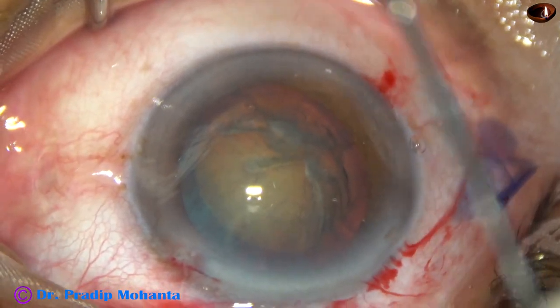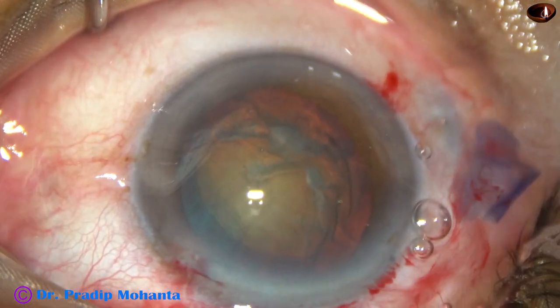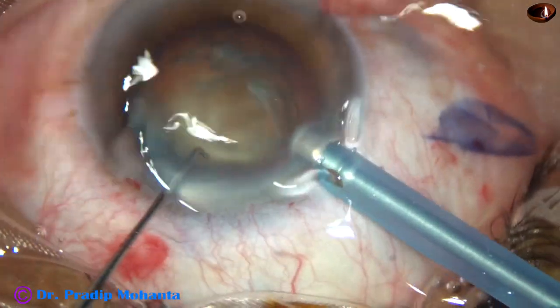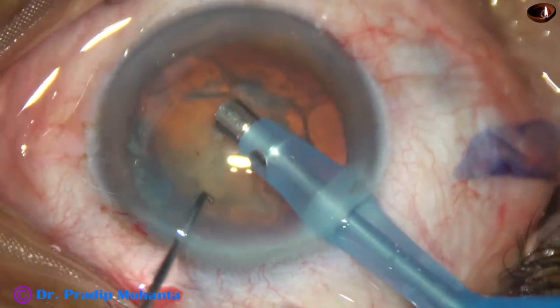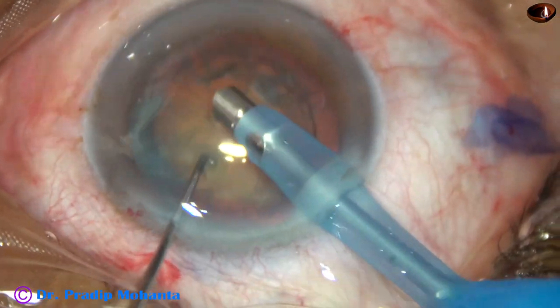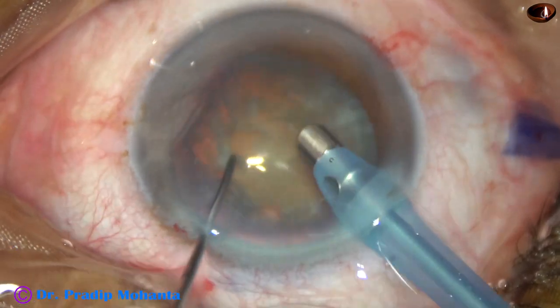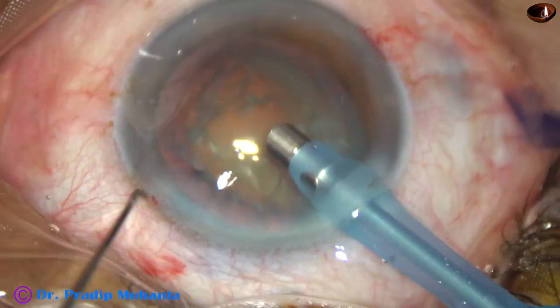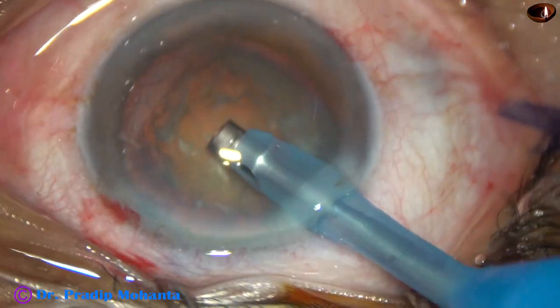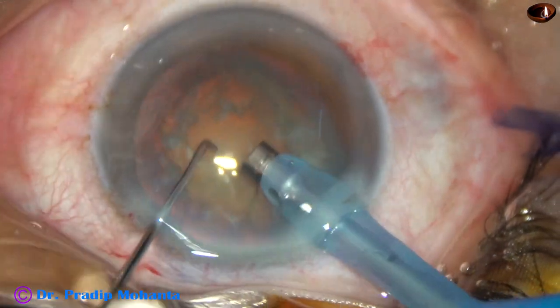And now the anterior chamber is filled up again with viscoelastic. And then the tip of the phaco needle is introduced. The phaco needle enters into the eye with its bevel down towards the nuclear mass. Some superficial cortical lens matter is removed. The nucleus is rotated again. And now the handpiece is turned — bevel is made up towards the cornea.